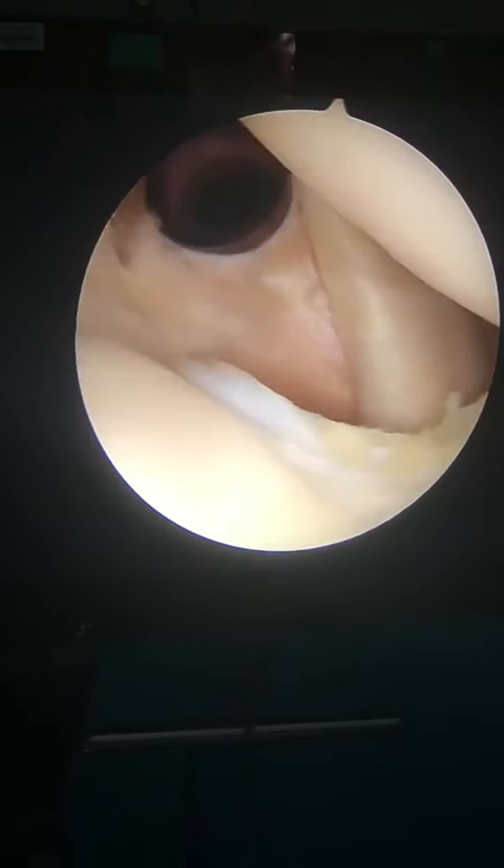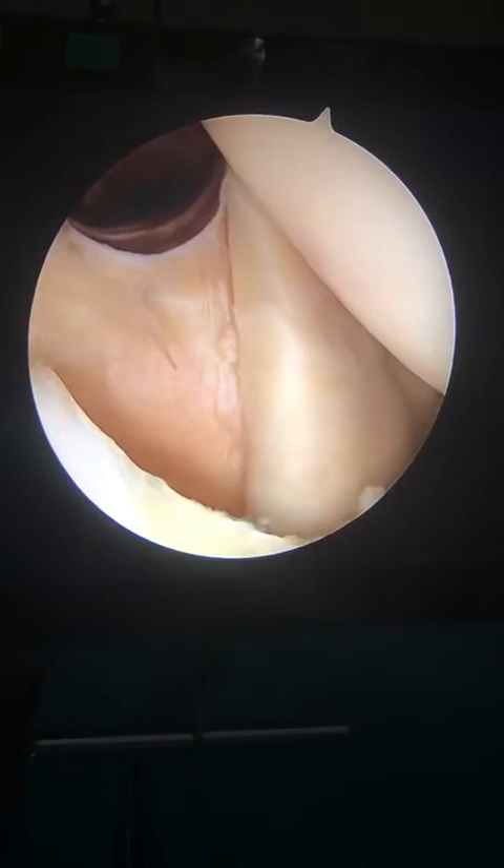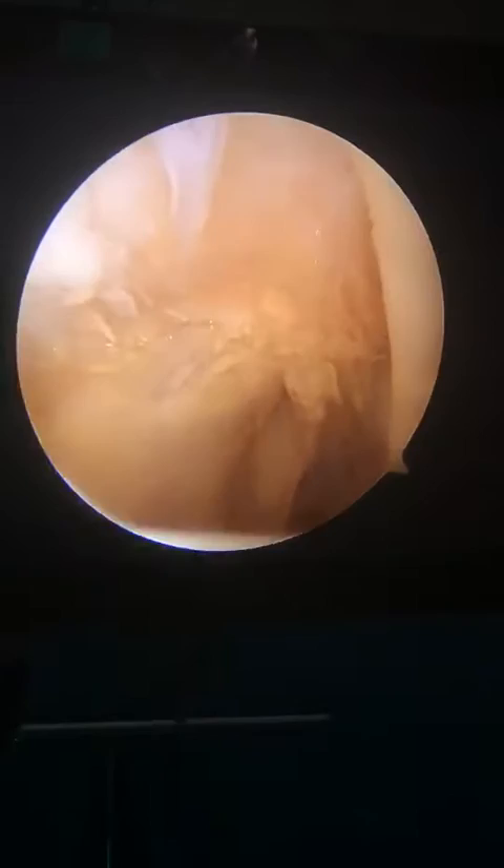If I go out in front here, this is the subscapularis tendon, which is one of the four rotator cuff tendons. And that's looking pretty good.